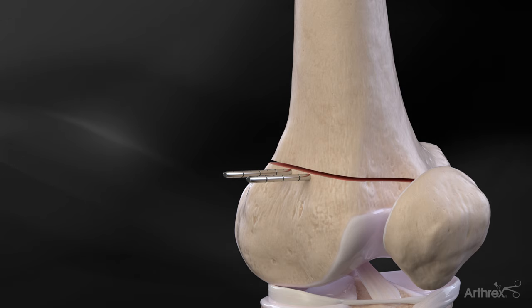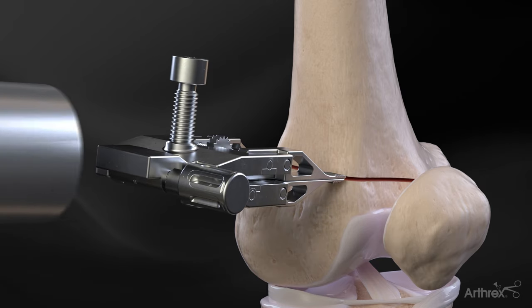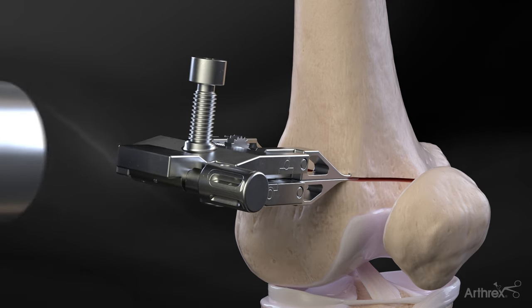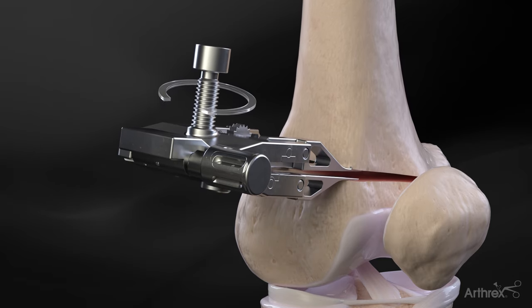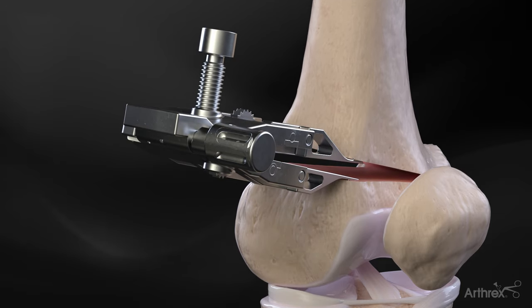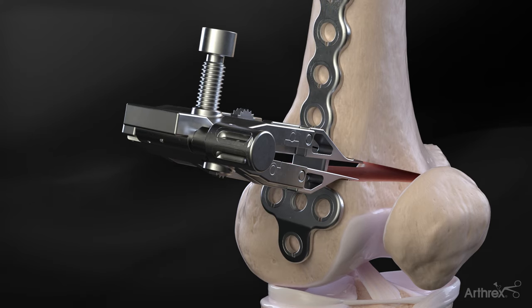Once the osteotomy is complete, the breakaway pins are removed. Once assembled, the paddles of the osteotomy jack are inserted into the osteotomy. Slowly and over time, the jack is opened until the degree of desired opening is achieved. The contour lock femoral osteotomy plate is then positioned in between the osteotomy jack paddles.